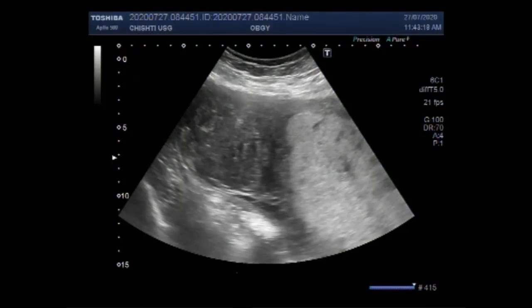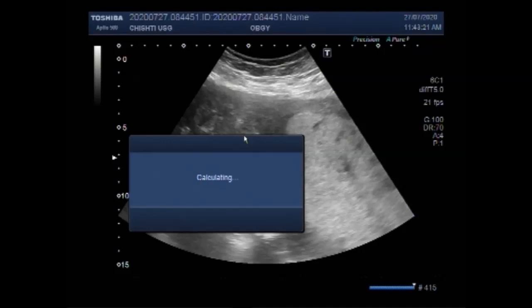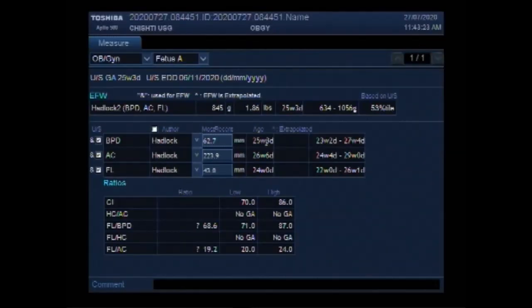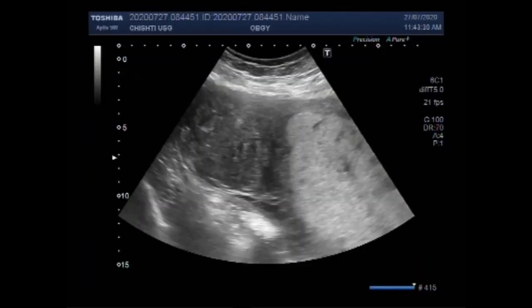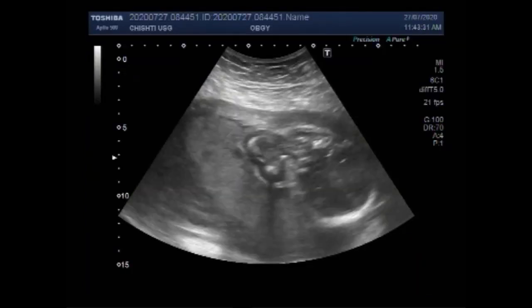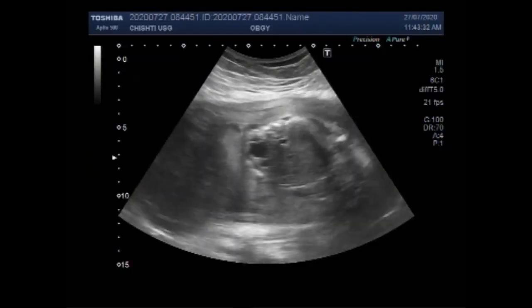Dear Waves, I hope you are all fine. This ultrasound video shows multiple fetal anomalies including cystic disease of the kidneys, oligohydramnios, sluggish fetus, and a large uterine mass.